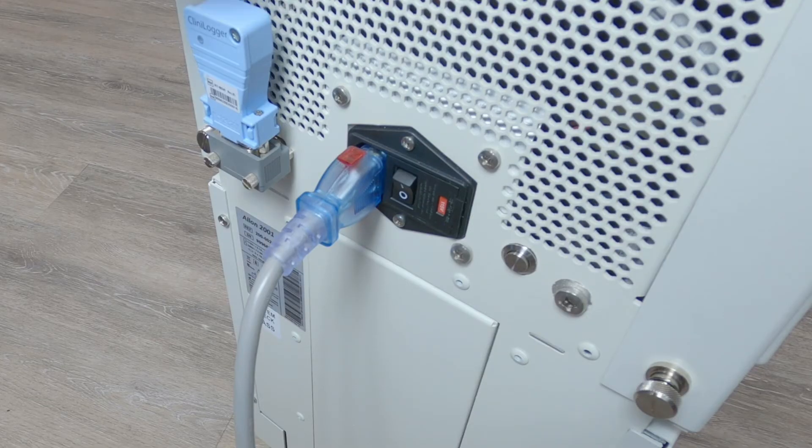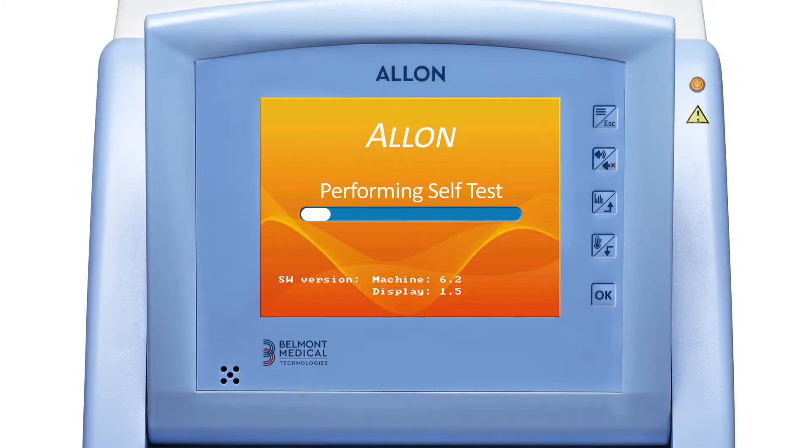Now that the wrap is connected, turn the machine on. The system initiates a self-test. It will take a few minutes to assure the system's safety.